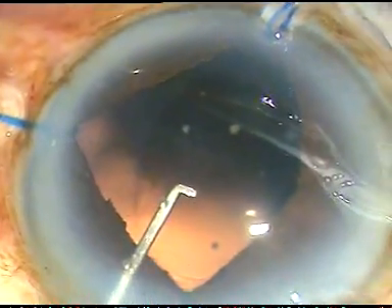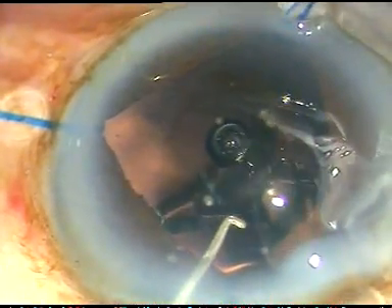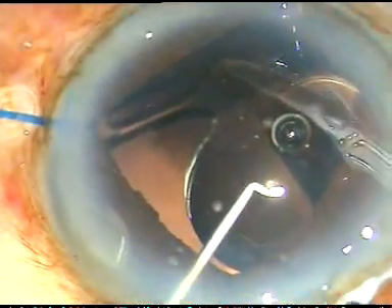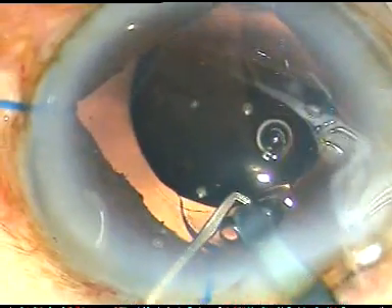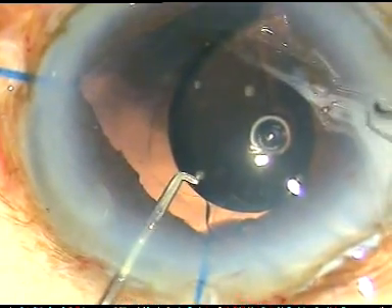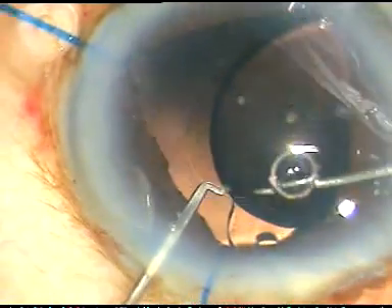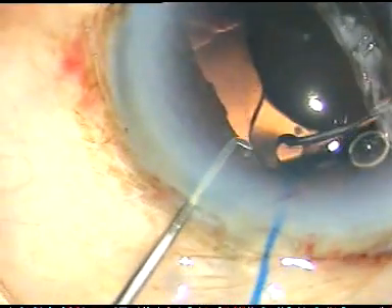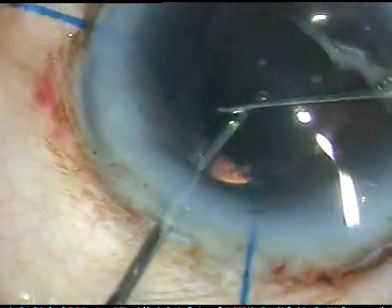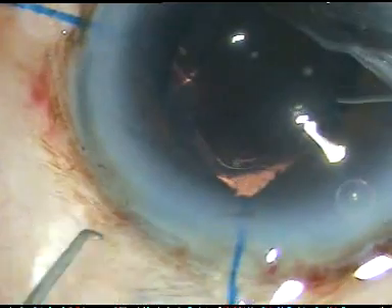However, this is a very good lens from Appasamy Associates — the NASPRO Hydrophilic Acrylic Aspheric Intraocular Lens. No financial interest, but I am very grateful to Appasamy Associates because they have helped me so much in building my practice. Now the lens goes into the capsular bag.